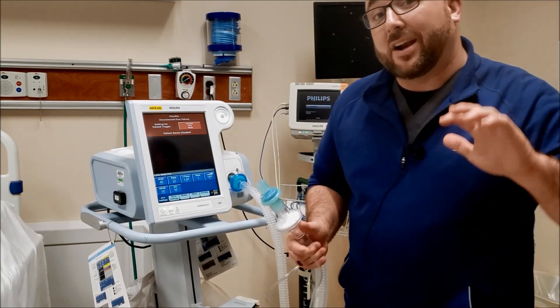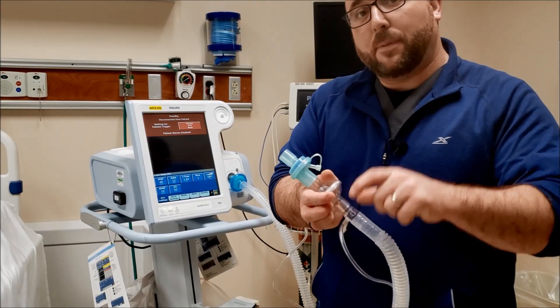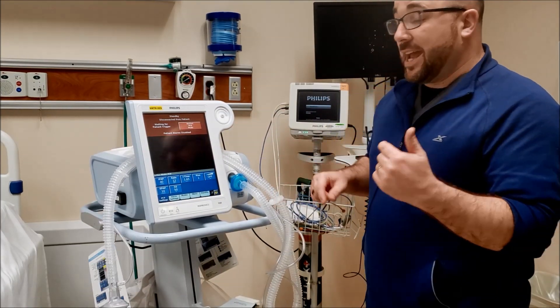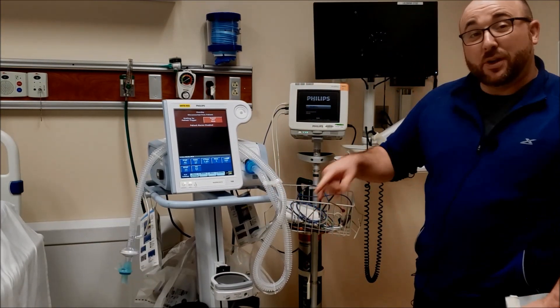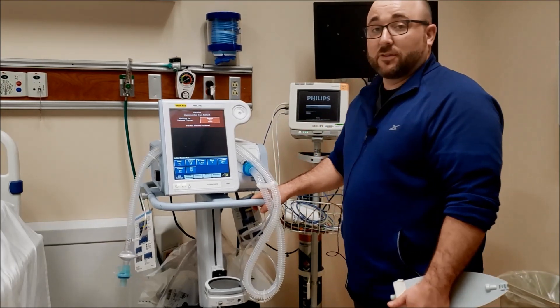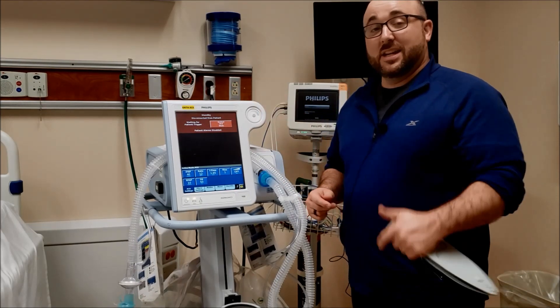When trying to limit aerosol generation, there are different types of hookups where you can put filters directly on the expiratory valve. I'm going to put some extra filters on and show you how to use it as a ventilator. It also has a built-in battery so you can transport on it. At the bottom there's a place for two oxygen tanks, making it a fully transportable ventilator. The battery lasts quite a while — internal battery, oxygen flowing in — great to use if you're out of ventilators.